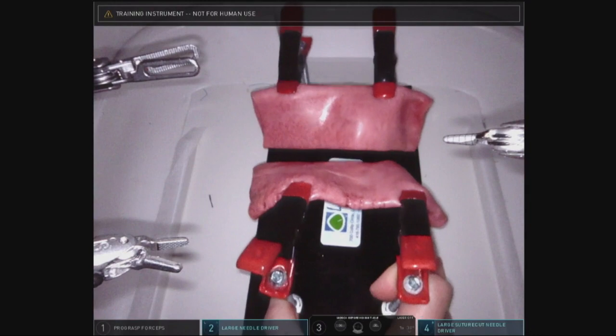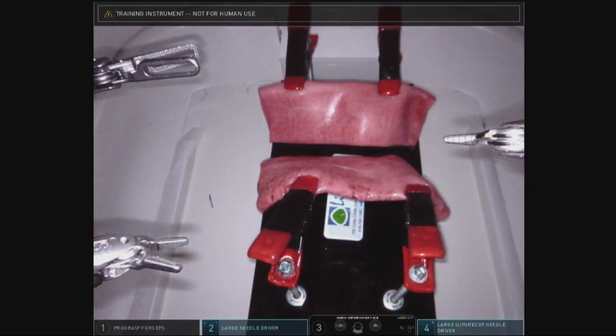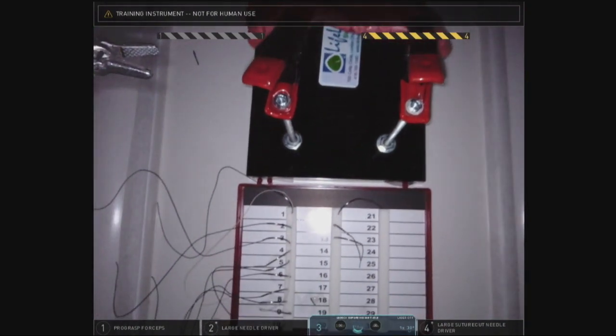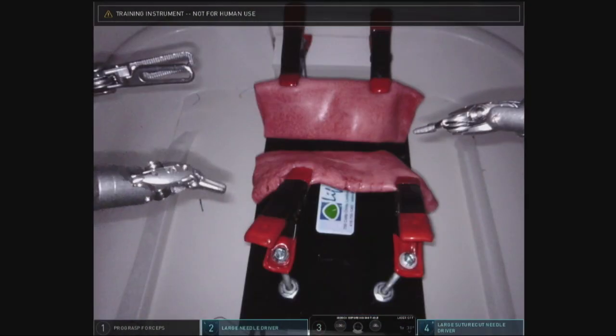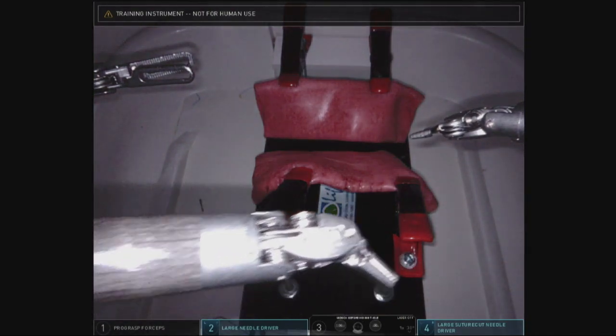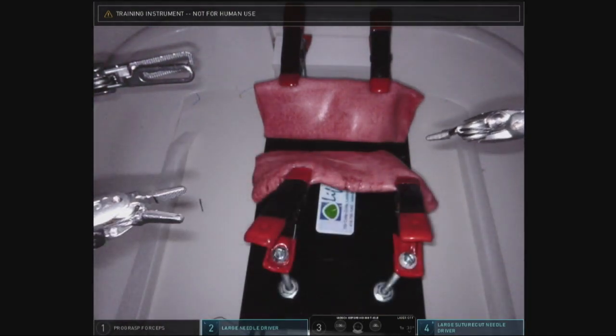So put the stent into the trainer box and your needle box as well, which should have a bunch of silks and a couple of 3-0 vicryls. Again, check your robot instruments, basically the same as before.